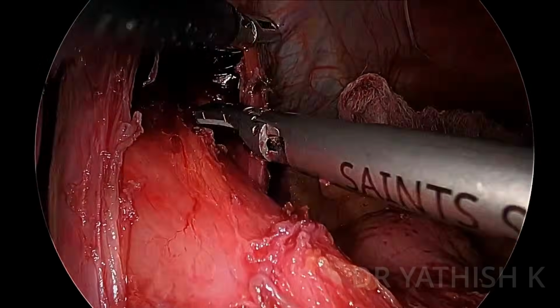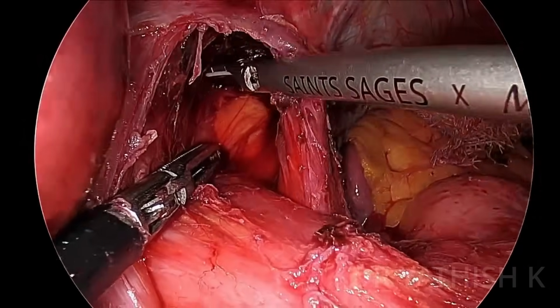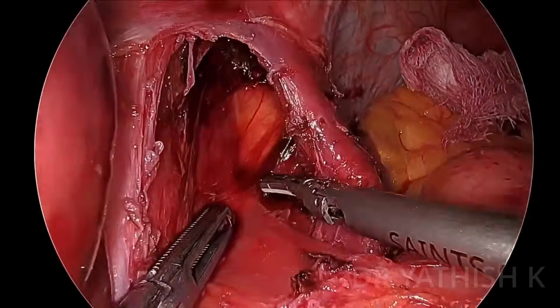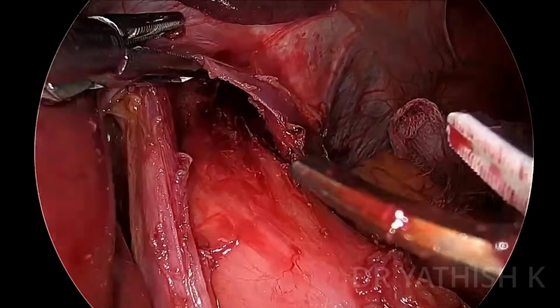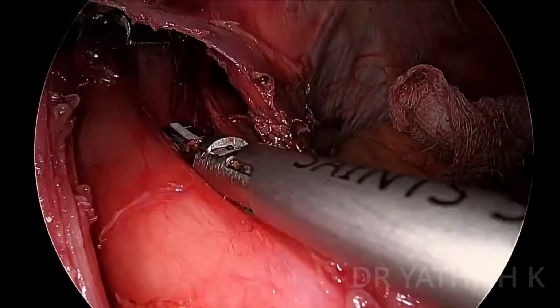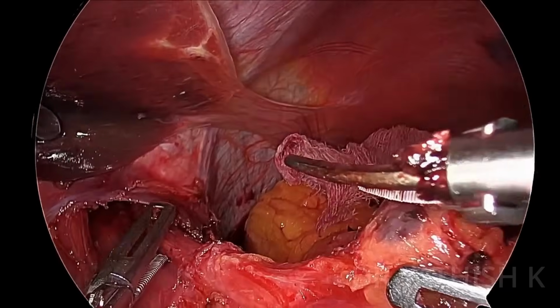So you see, I'm reaching to the root where the vagus divides into anterior and posterior. It's better to identify the nerve a bit proximally than distally, because distally your nerve will branch out, whereas proximally you'll just have one single trunk. That's what I'm trying to do.